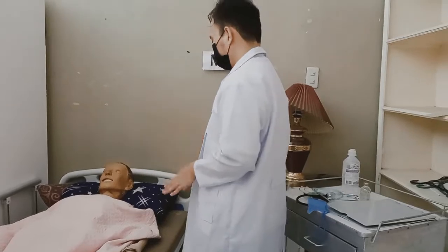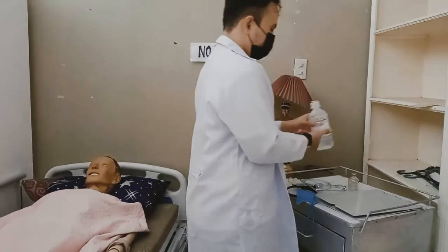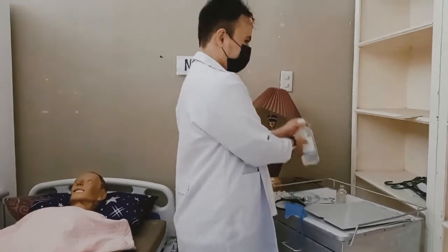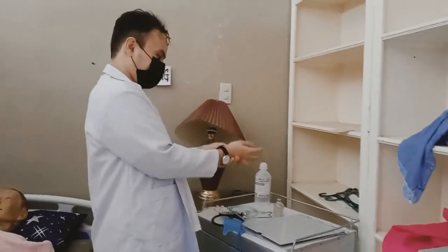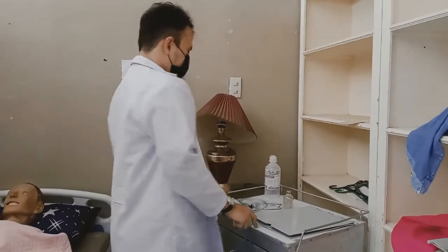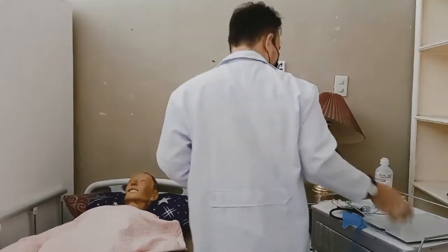Ensure that the patient receives the medication at the correct time. Perform hand hygiene and put on PPE if indicated. Identify the patient. Usually, the patient should be identified using two methods to confirm information.